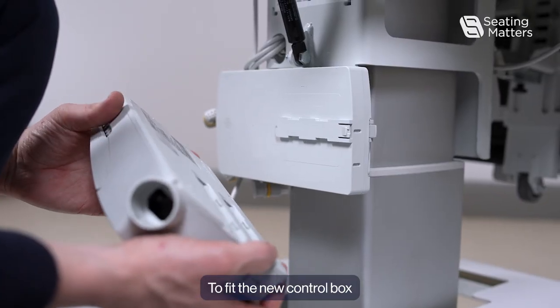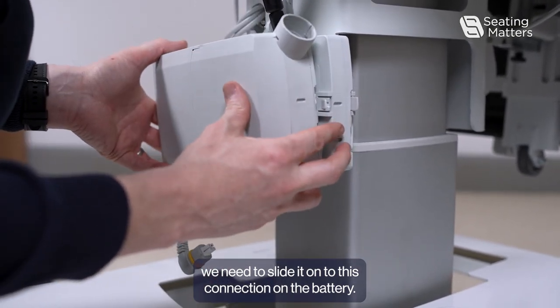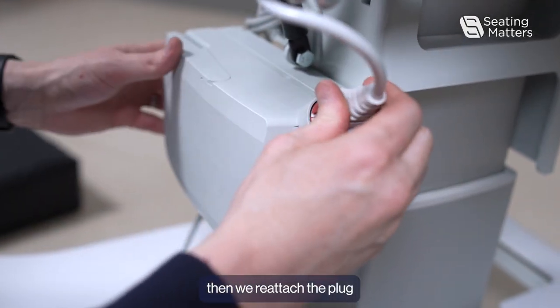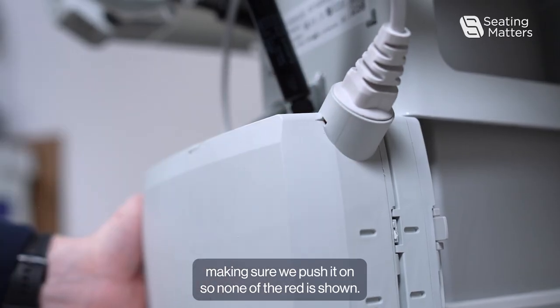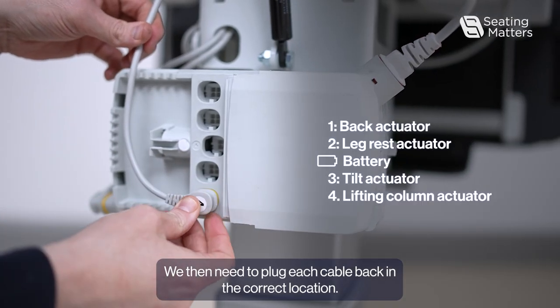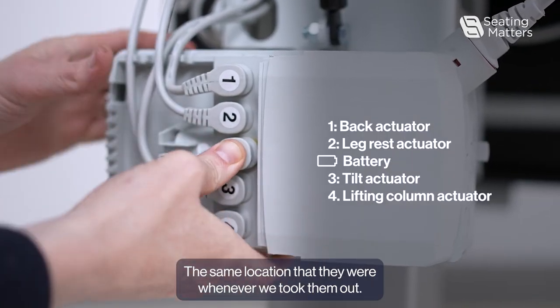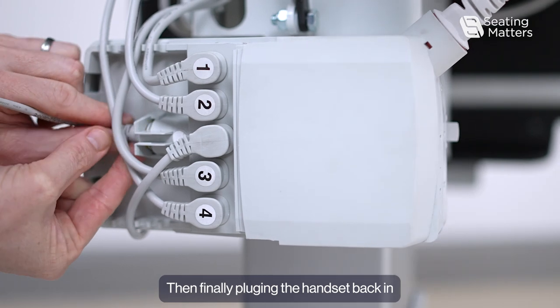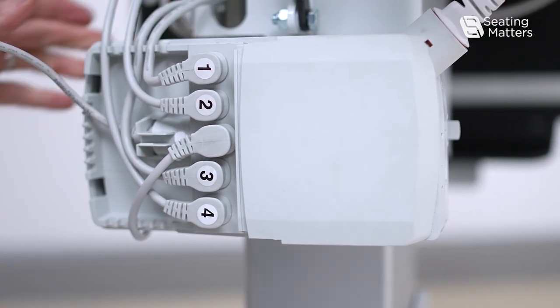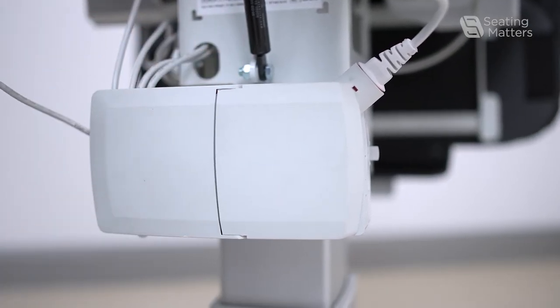To fit the new control box, we need to slide it on to the connection on the battery. Then reattach the plug, making sure to push it in so none of the red is shown. We then need to plug each cable back in, in the correct location — the same location they were in when we took them out. Then finally, plug the handset back in and close the cover on the control box.